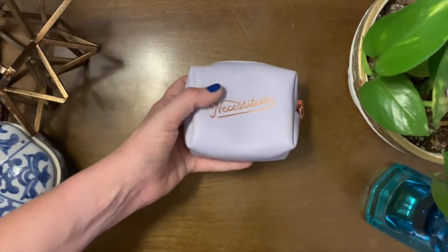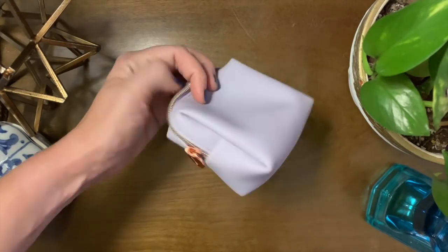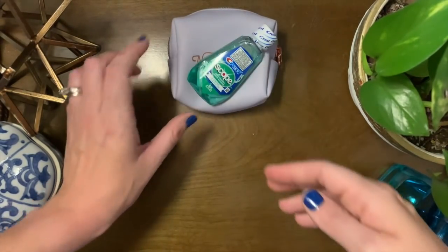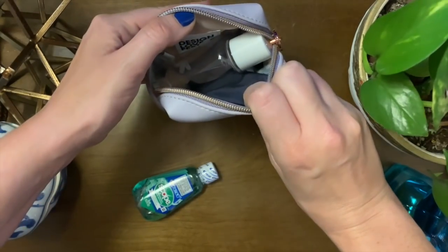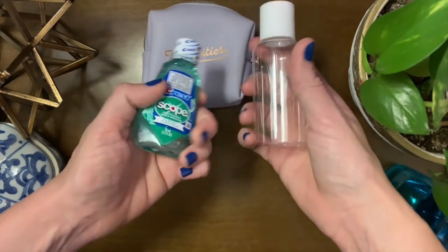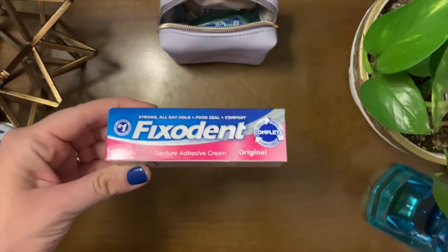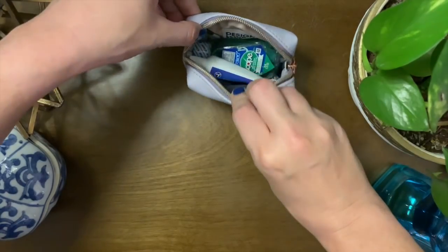Now we're going to get into the travel kit — and by travel I mean going to a restaurant where you might end up with a lot of stuff in your teeth and need to be prepared. The Listerine I like doesn't come in a travel size, so you can buy a little Scope bottle for 99 cents — it's bigger — and put your mouthwash of choice in it. It fits in this little bag nicely. Fix-A-Dent original adhesive comes in a travel size, but their powder doesn't — stay tuned because I have a hack for that.